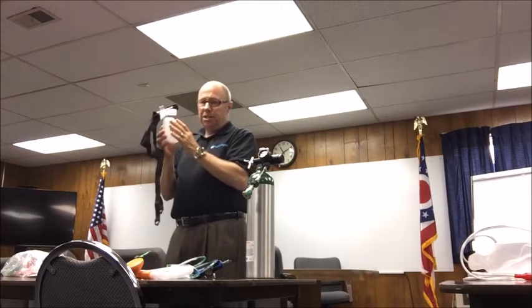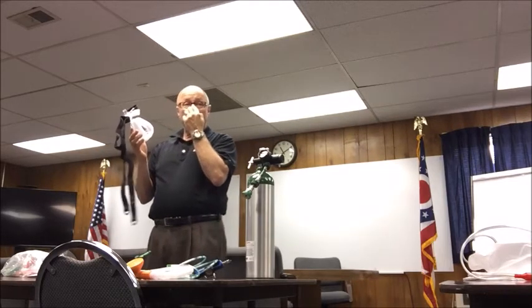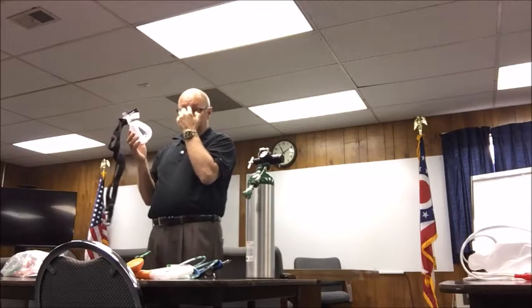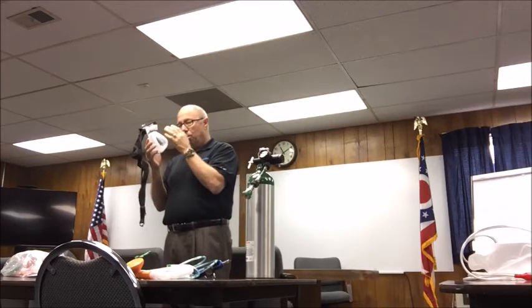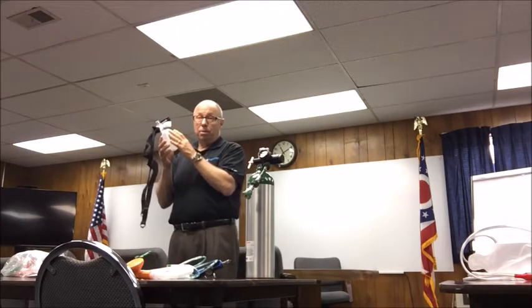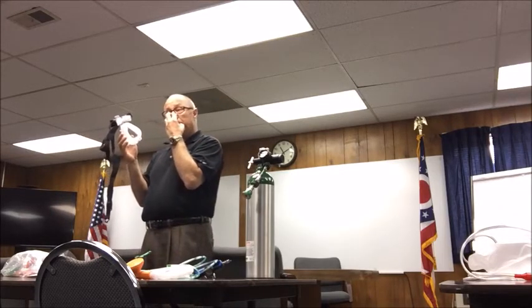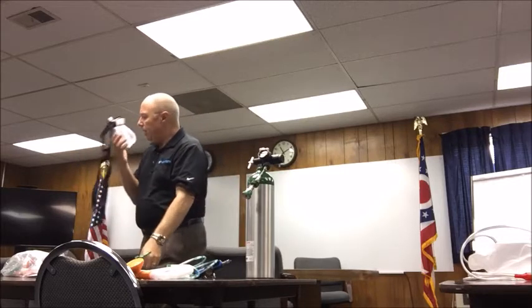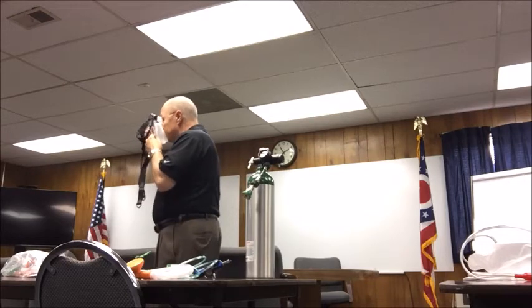Where you want to size this mask, and this is very important, you want to size it at reading glass level, not at eyeglass level. The reason why is if you get it up high and you have any blow by, you're going to blow that flow into the eyes of an agitated patient. You're going to agitate them even more, okay? So you want to keep it low. When we're delivering CPAP, all we really want to cover is the mouth and nose, okay? So, reading glass level, just like that, and everything's good.